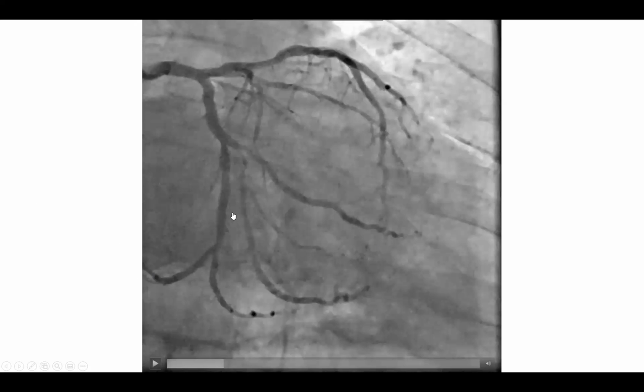Okay. In this case, for example, what I would do, I would wire both, I would stent across into the lower branch and jail that upper branch. I think the lower lesion is tighter and maybe has a larger territory. So again, provisional still applies. For example, in a PDA, PLB bifurcation of this RCA, you still choose one as your main branch and the other as your side branch to be treated provisionally.